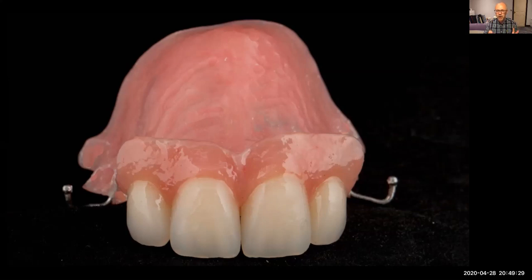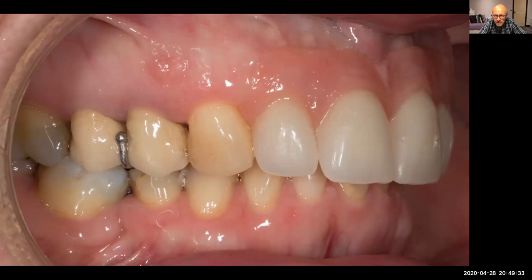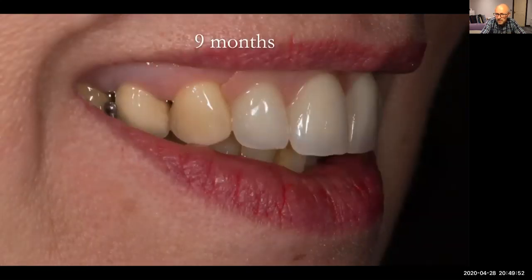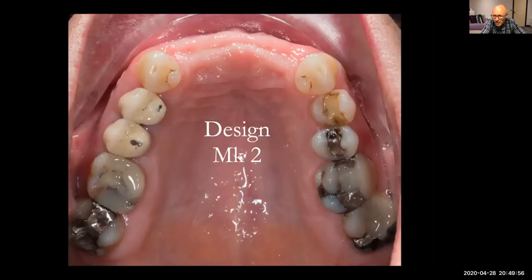Now she's in a good holding pattern, ready for a denture later on down the line. So this is the immediate in place. We've got this, look at that beautiful flange fitting. It looks great, you can't see that join. And then if we now fast forward 9 months from this point, here we go. We're now ready to make Mark II, the definitive.